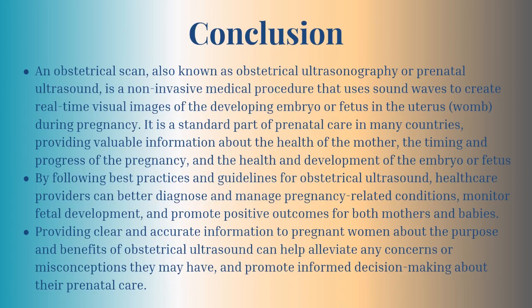In conclusion, an obstetrical scan, also known as obstetrical ultrasonography or prenatal ultrasound, is a non-invasive medical procedure that uses sound waves to create real-time visual images of the developing embryo or fetus in the uterus or womb during pregnancy. It is a standard part of prenatal care in many countries, providing valuable information about the health of the mother, the timing and progress of the pregnancy, and the health and development of the embryo or fetus.